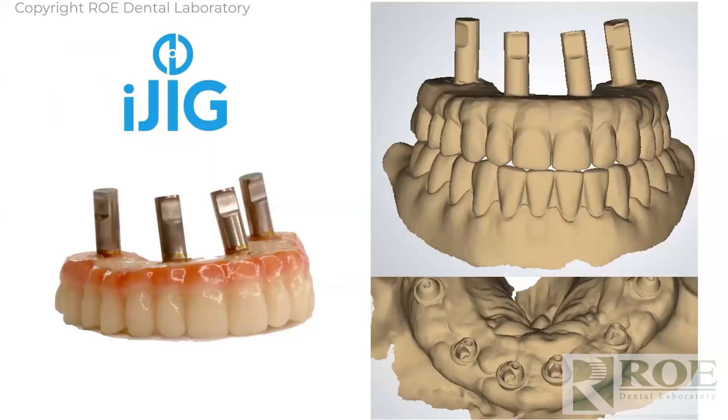I don't want to go through the whole process as it takes a while, but essentially you take the prosthetic out of the mouth and scan the mouth first. The bottom right image shows you just scan the tissue and send it off to the lab — that's the first event on the IOS scanner. Then open up a new event, unless you're working with Cerec or similar systems where you can stack multiple scans, as sometimes scans can get lost when the scanner looks for working, opposing, and bite.